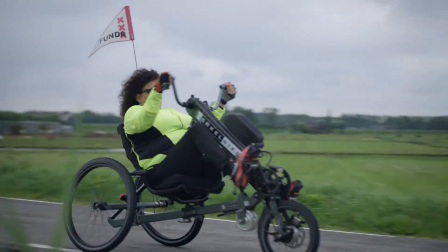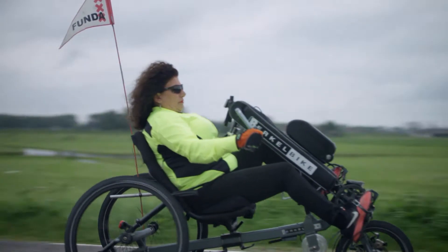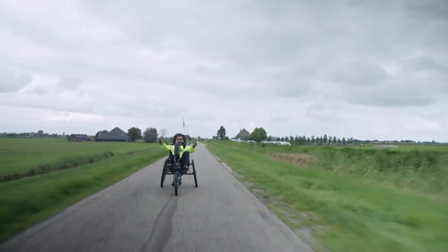The BerkelBike has two models: the BerkelBike Pro and the BerkelBike Connect. This video is about the BerkelBike Pro.